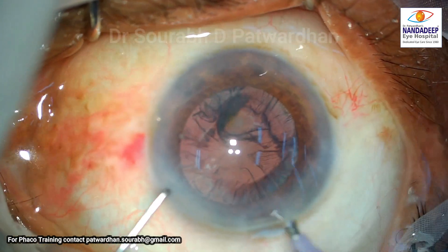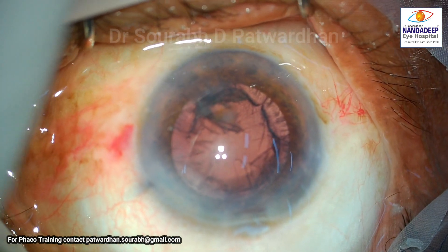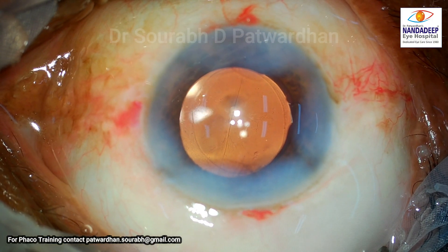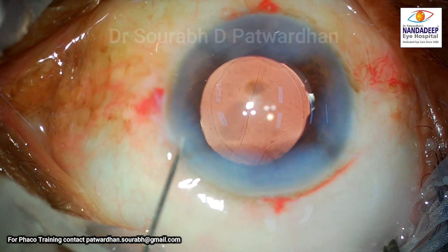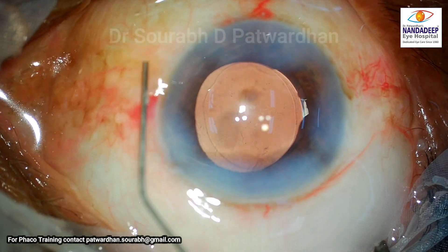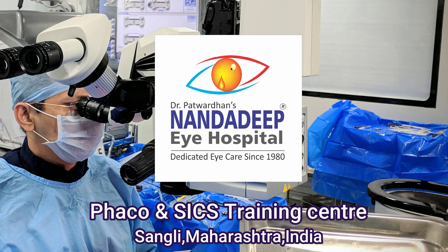The surgery itself ended quite well — the surgeon was able to place the IOL in the bag, with well-hydrated incisions, and the patient will have a very good outcome. But from the audit, you can see the downward rotated globe, the very anterior phaco emulsification, and the phaco tip not in the central safe position — these are the mistakes the surgeon can improve upon.